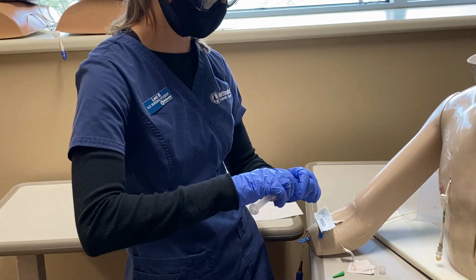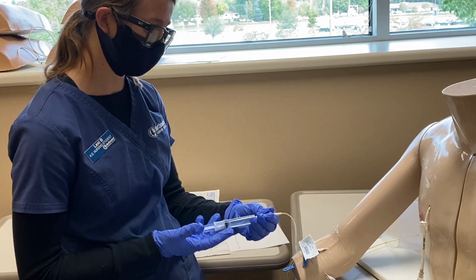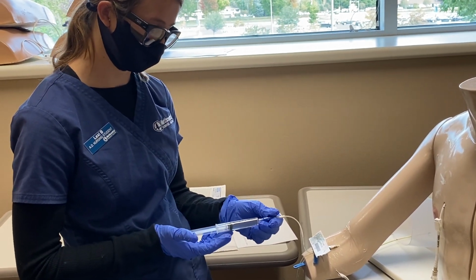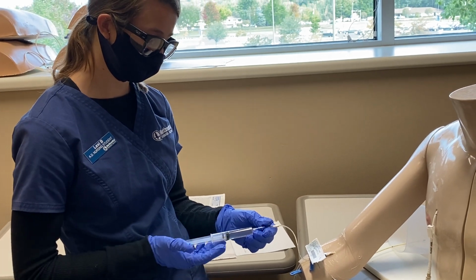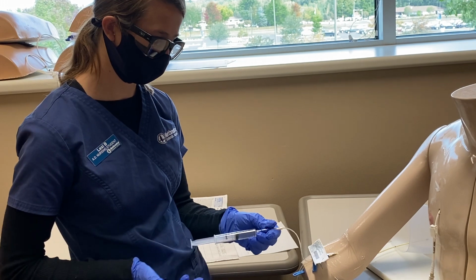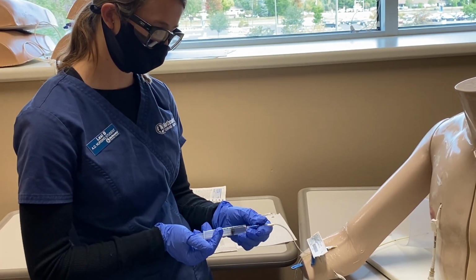And this one, I'm going to be administering with a pulsating method. So I'm going to be doing 1 milliliter per minute and then stopping. Again, for time purposes, I'm going to speed it up a little bit. And I'm going to assess my IV site.